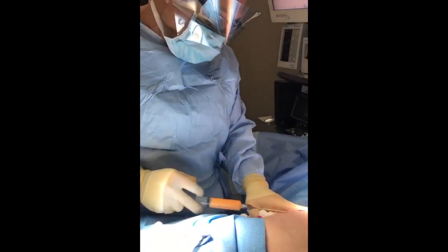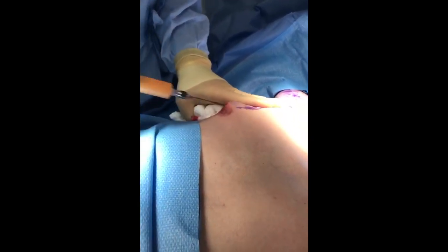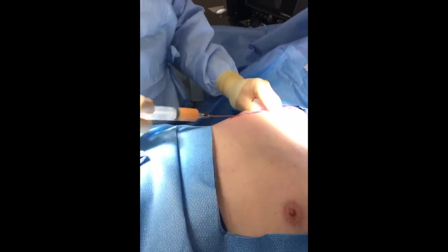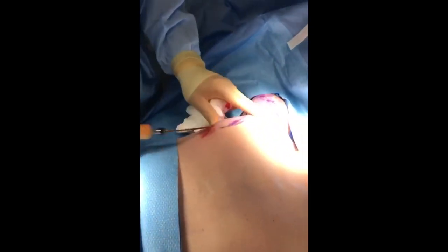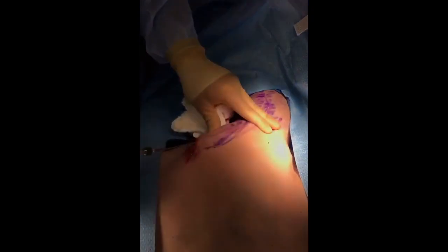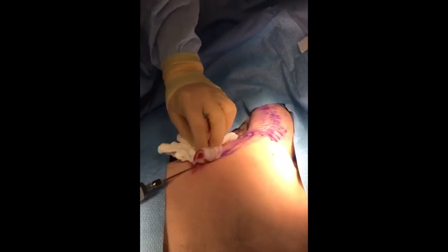He's missing some muscle, so I have to recreate the ridge of muscle that goes between his chest wall and his arm. Unlike fresh fat, this frozen fat takes a little less — normally it's about 60% take, but this is more like 40% take. So we have to over-inject to compensate for that.